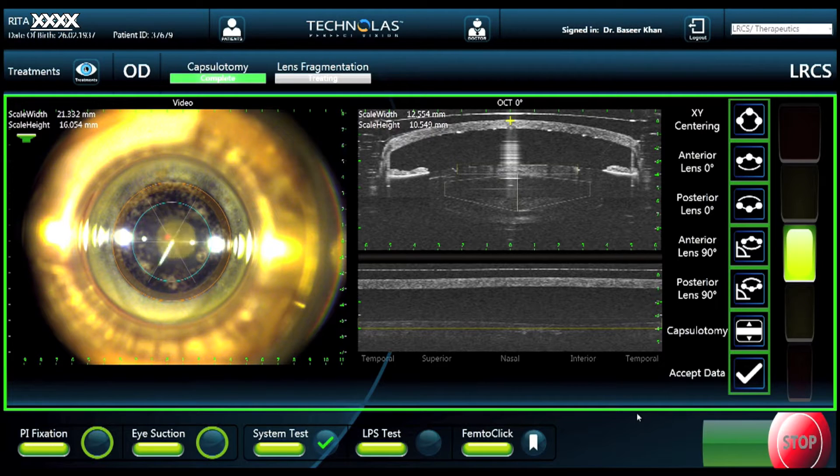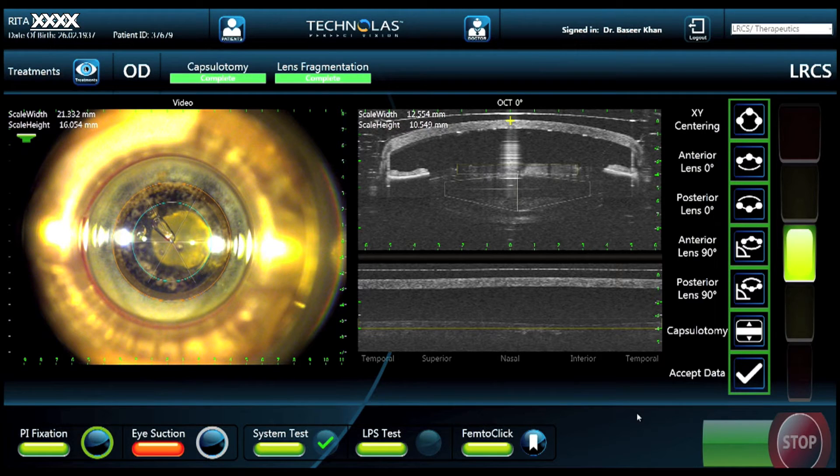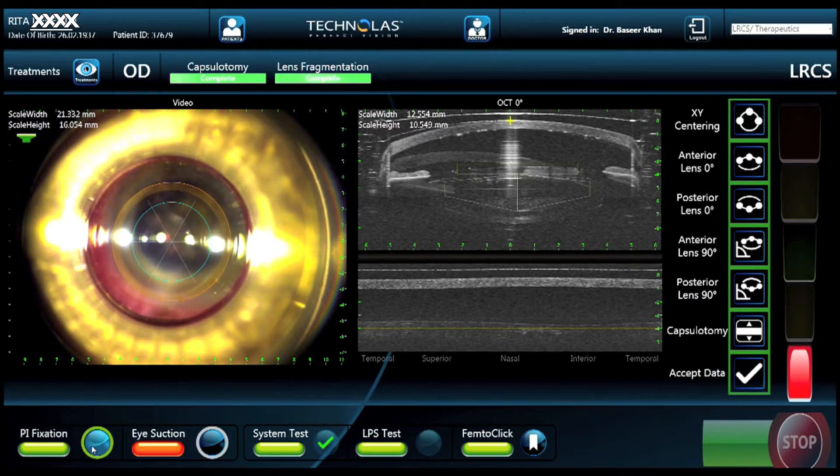Momentarily, you'll see the lens fragmentation starting, and you can see an intralenticular bubble forming as the laser energy is delivered. Some of these bubbles do come anteriorly, but the bulk of the bubble stays within the substance of the lens. Finally, as the treatment is completed, the patient is pulled away from the patient interface.